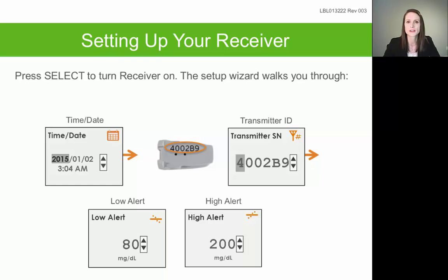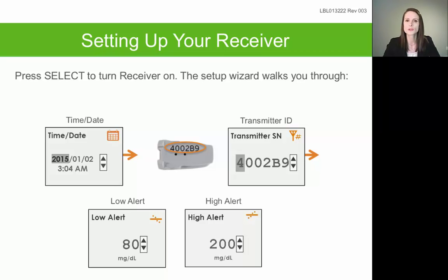The date will be displayed as the year, month, and then the day. It will then ask you to enter your transmitter serial number, otherwise known as your transmitter ID. Each transmitter is assigned a unique ID number that you can find on the very back of the transmitter or on the white sticker on the box it came in. It's a series of six letters and numbers that should start with the number four, and you manually enter that ID so your receiver knows which transmitter to communicate with.